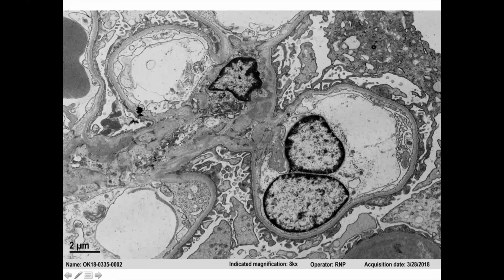أكيها عندنا هذه الميزانجيال سيلز, والإلكترون دنس deposits طالع 1 2 3 4. أكيها they are surrounding the mesangial cell. Over here there's another one over here. أكوها عندنا هني بعد electron dense deposits. So we have mesangial which goes ويا الفايندينج مالتنا مالت IF, إن إحنا immune complexes مالتنا موجودين في الميزانجيوم.